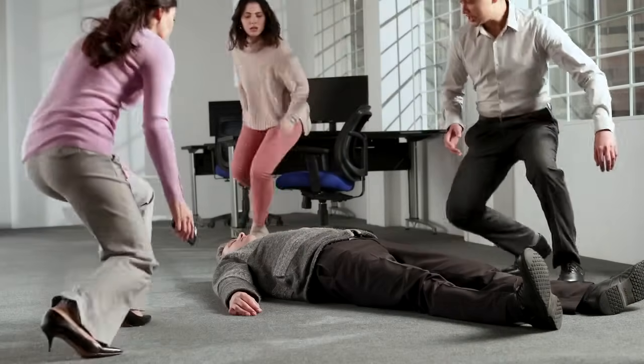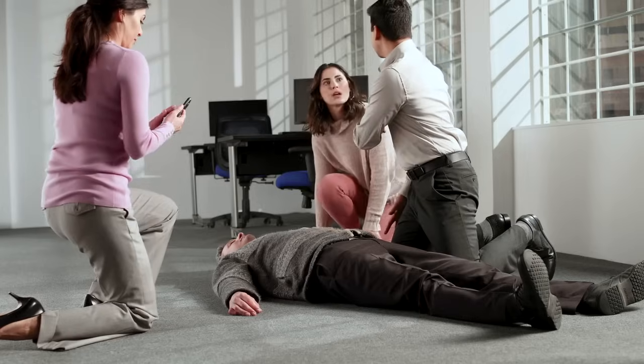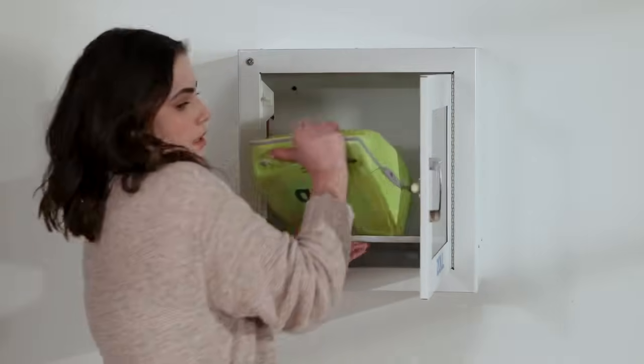Did you see what happened? Michael, are you okay? Are you okay? You call emergency services, you get an AED. Hurry, I'm going to start CPR. Call emergency services, have someone retrieve the AED, and begin CPR immediately.